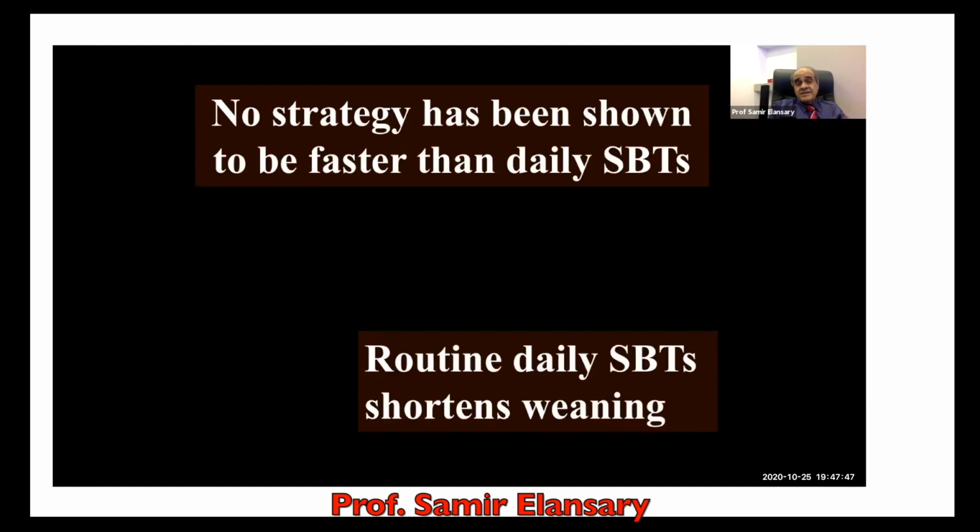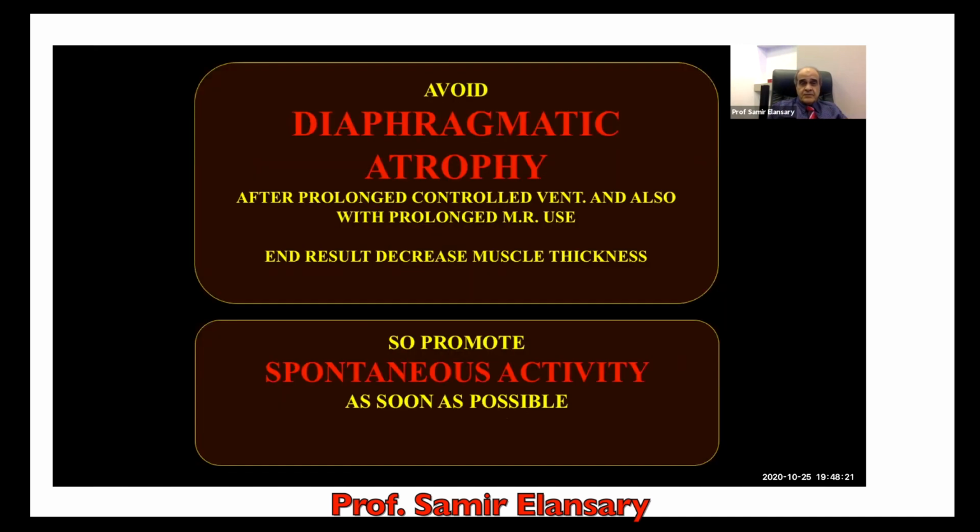Also, there is some important point for weaning your patient. And I wanted to say, don't touch the ventilator. Depend on spontaneous awakening trials daily and also spontaneous breathing trial. Try to go down with sedation during your making rounds in the early morning. You have to ask the nurse in the ICU, stop the sedation. I want to evaluate my patient and see the spontaneous, gives the patient chance to spontaneously breathing daily, and also adjustment of sedation dose and going down with sedation.